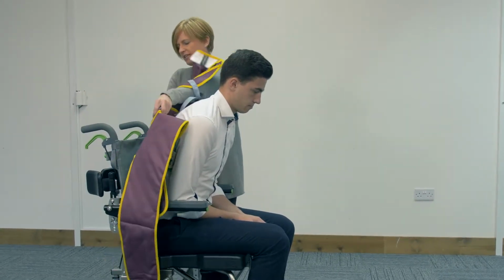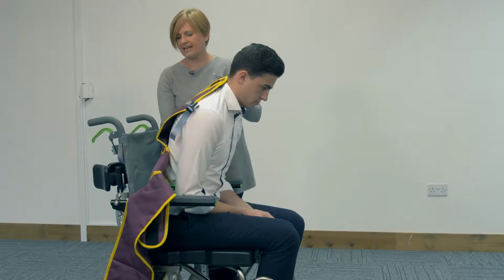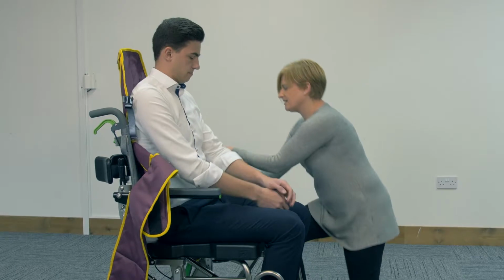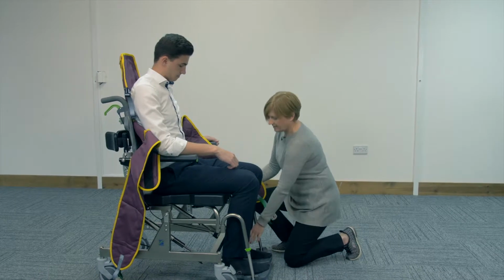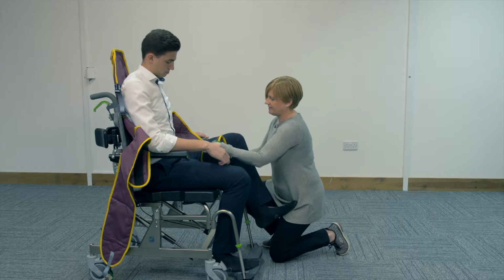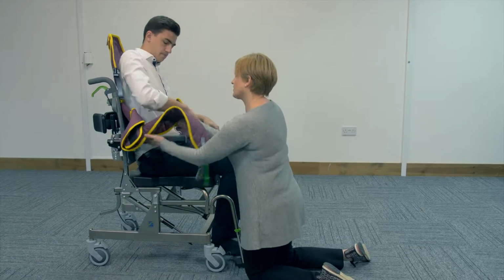I'm just positioning the material down the back for the user, and then they can sit back and relax into the back of the chair. Then I'm coming around the side to position the leg channel. If I put your foot on my thigh, and then we do the same on the other side. So bringing the leg channel round.